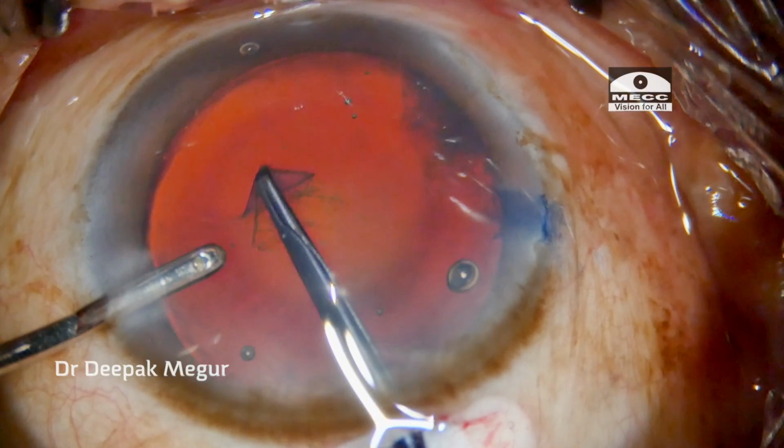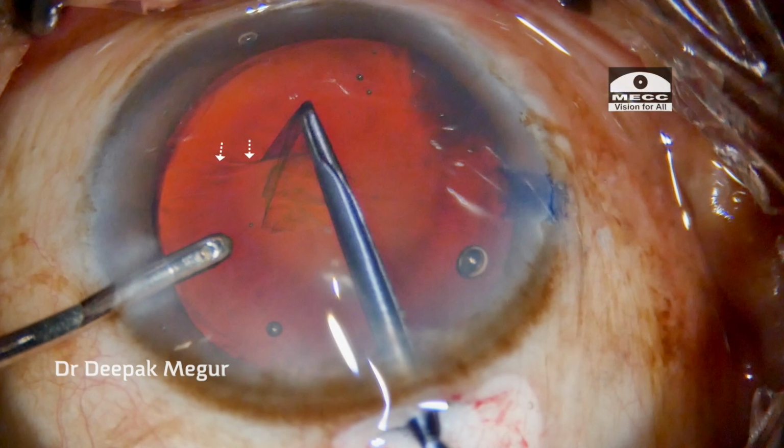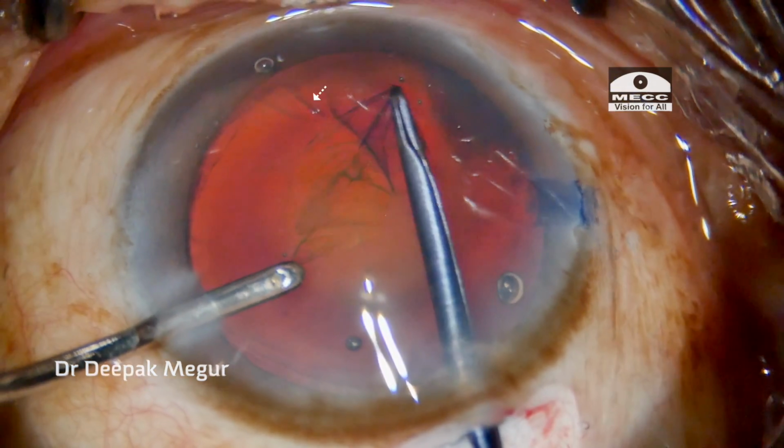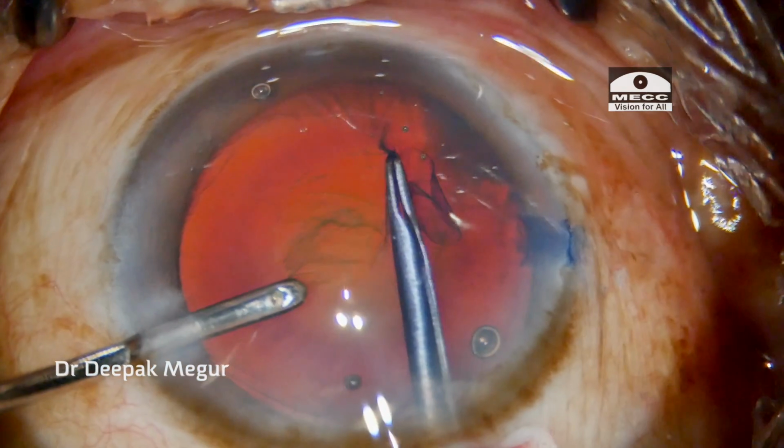Another case of generalized zonular weakness. The wrinkling of the adjacent capsule is clearly visible when the rhexis is being performed. All these subtle signs warn us regarding the health of the zonules.